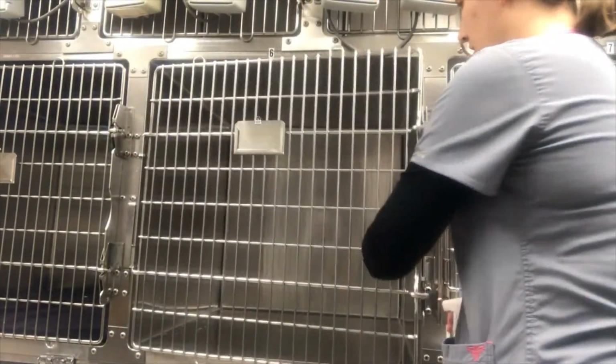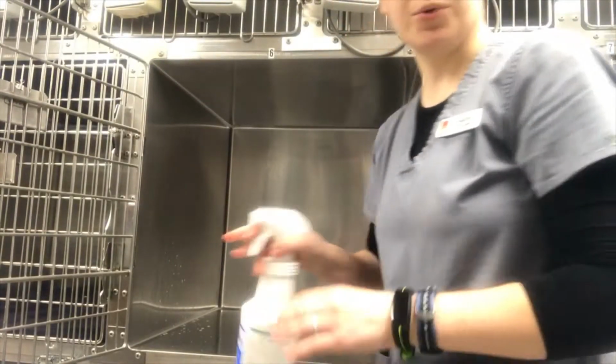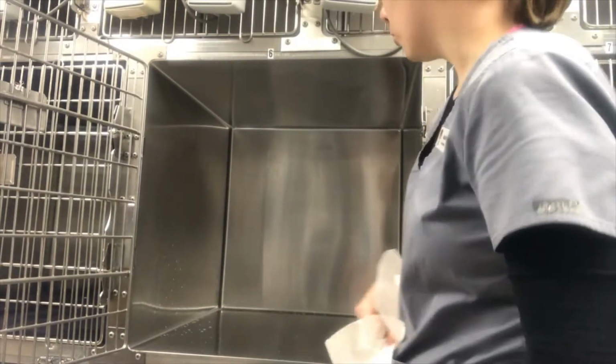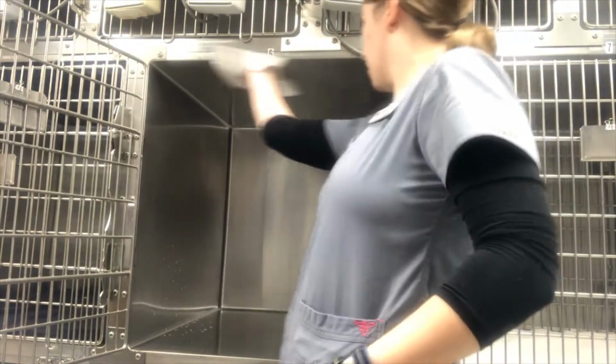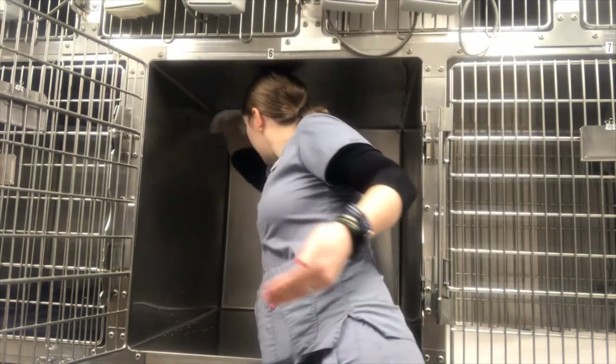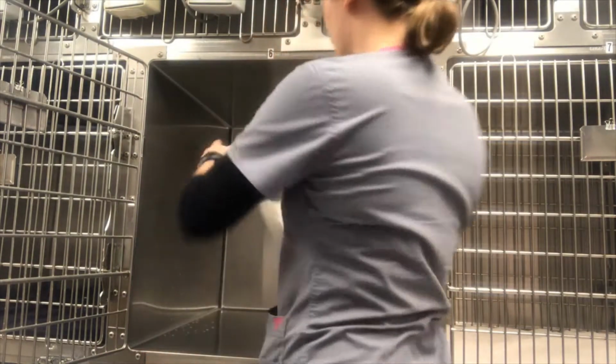So our timer for the contact time for Rescue for a minute has just gone off, so now I'm going to wipe it out. So first off, I do another quick spritz just to help loosen up any debris. And taking some towels or washcloth, wipe in the proper order. I'll start with the top. Make sure I get all the corners. Then I'll do the 3 sides.